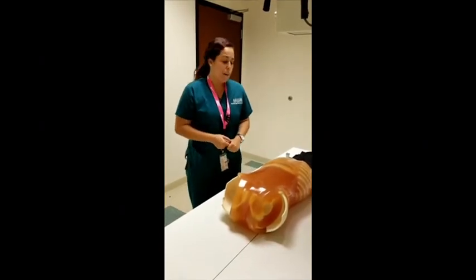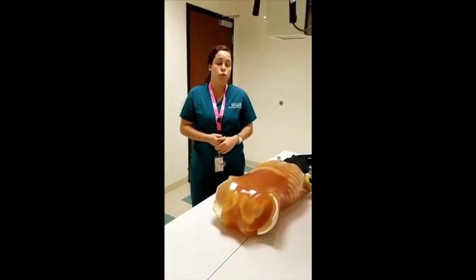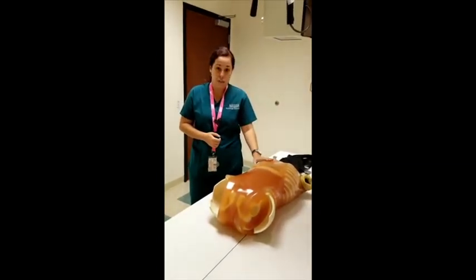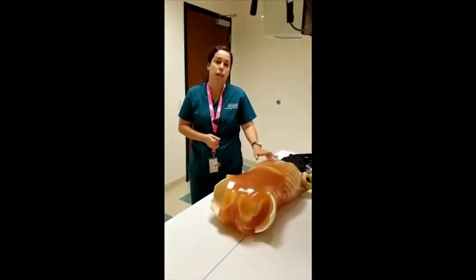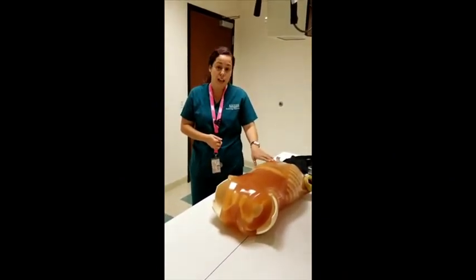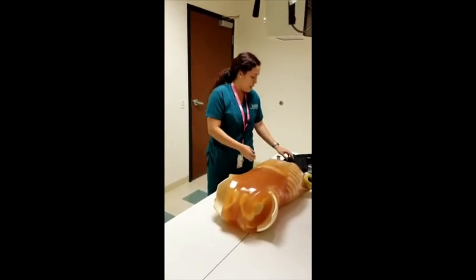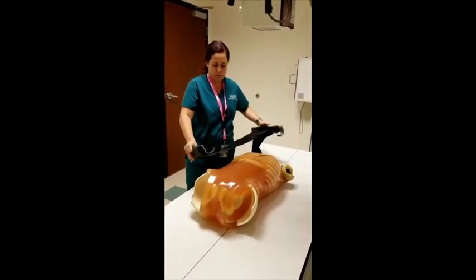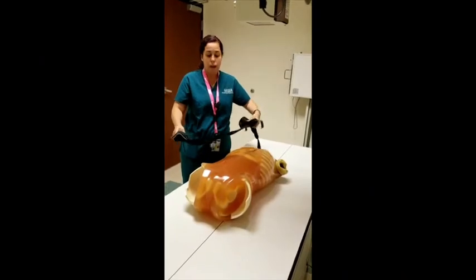Okay, one of the biggest sources of scatter is usually the patient, and it depends on the patient thickness. Therefore, there are ways that we can try to limit the production of scatter or reduce it from reaching our images. One of the ways is by using a compression pad or a compression paddle.